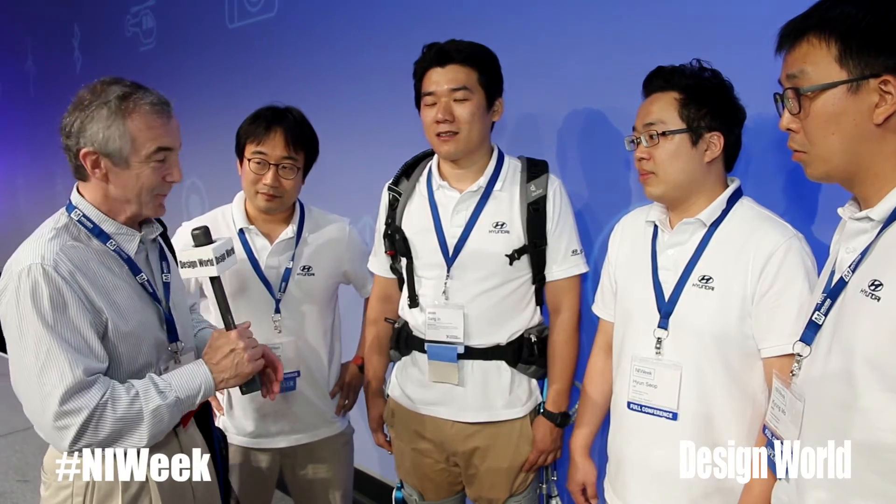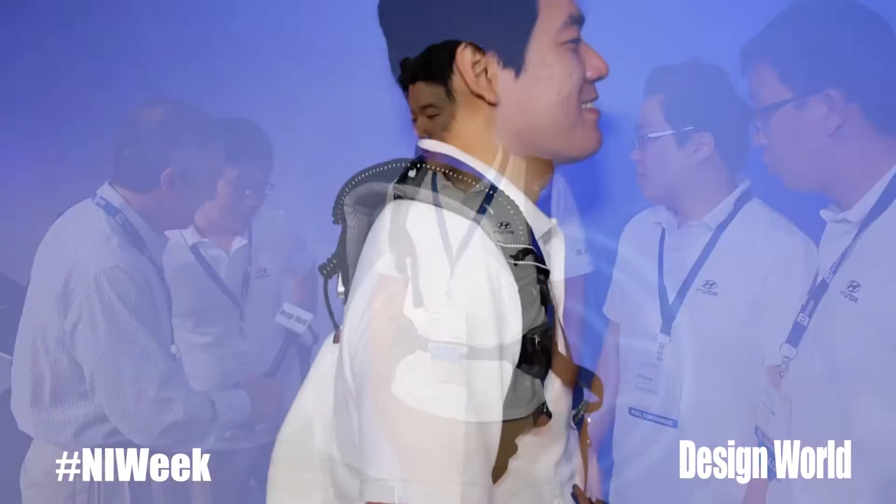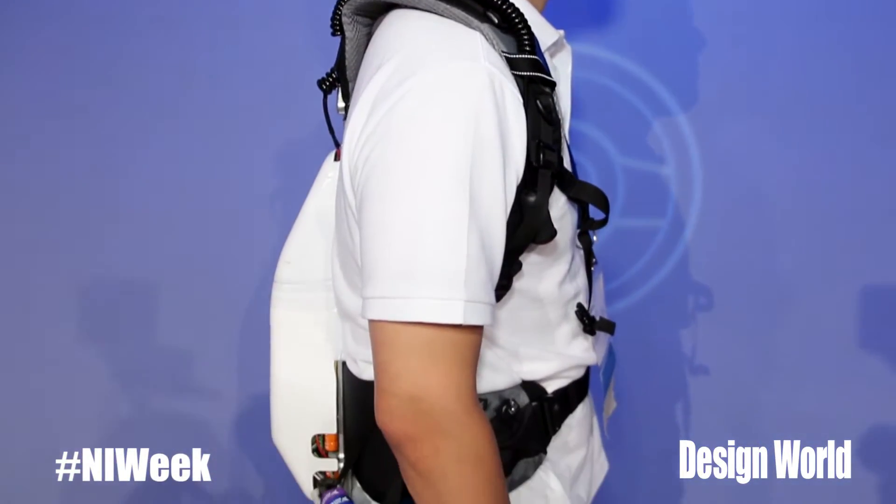We're here with the team from Hyundai Research and their exoskeleton. It's pretty interesting because it helps disabled people get around. Can you tell us a little bit about the actuators in the exoskeleton? This exoskeleton is actually for the elderly people.